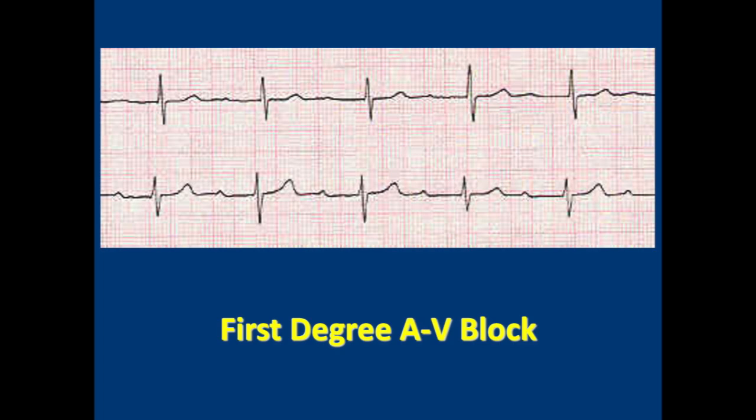On the far right, in the 2 QRS complexes just before you get to the end, after the T wave you'll see there is a P wave there, and it's a long PR interval before that last QRS complex on the right.